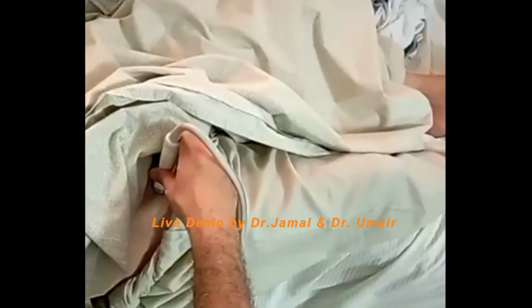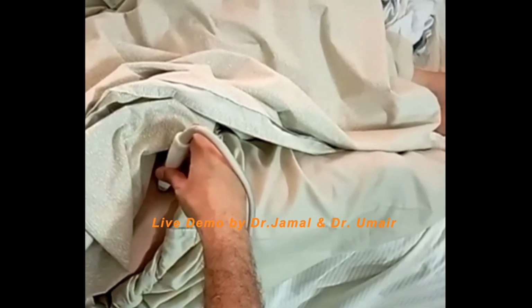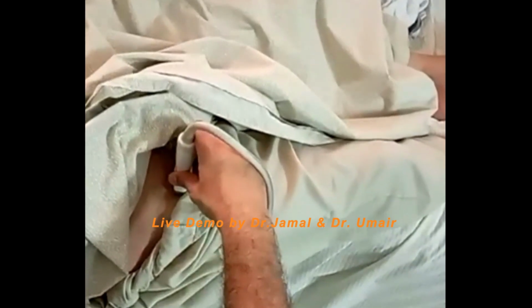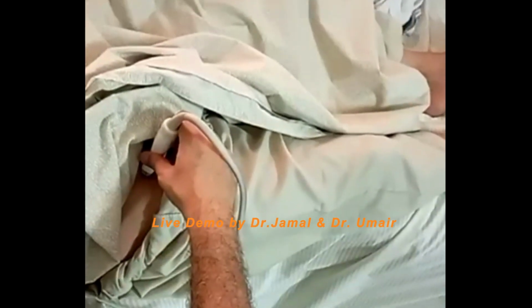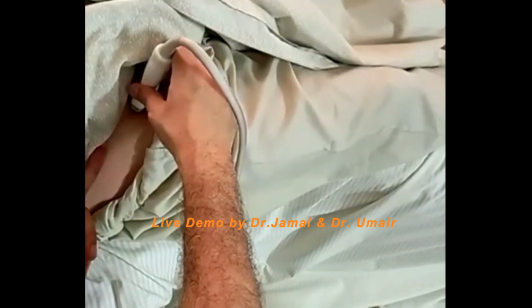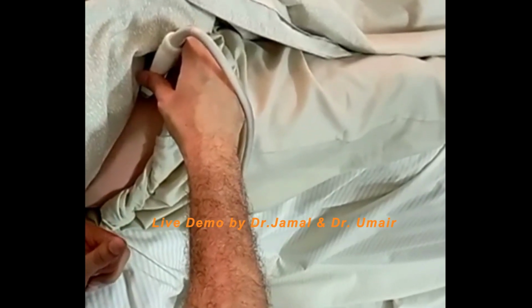We will note the position of the probe in relation to the femoral artery. The femoral artery is split into two, so we need to move the probe upwards. Here, as we go a little down, the femoral artery splits into two branches, the superficial and deep. So we will keep it at a point where the femoral artery is found as a single round structure, not divided. Then we will go a little lateral to find the femoral nerve, enclosed in a sheath formed by the fascia iliaca.